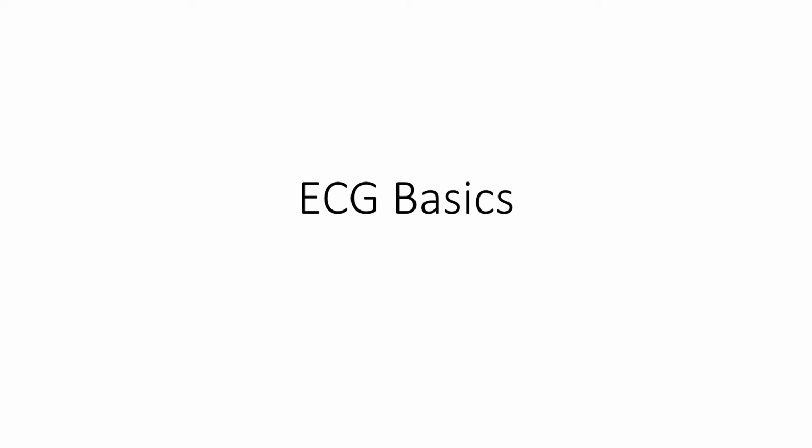So let's start at the beginning with a few words on ECG Basics. Most of your test questions on boards and clerkships will be on reading actual ECGs, so I will make this section concise to remind you about a few important concepts that you learned in your first year of physiology, and make sure that we're all on the same page. If you'd like a more in-depth, detailed description of the history of ECGs or of cellular electrophysiology, see Malcolm Thaler's book.